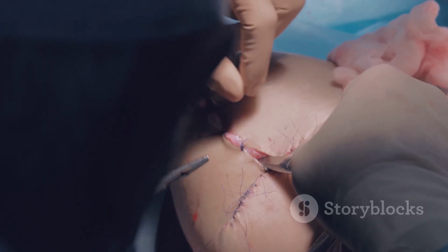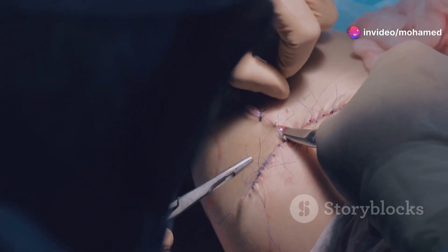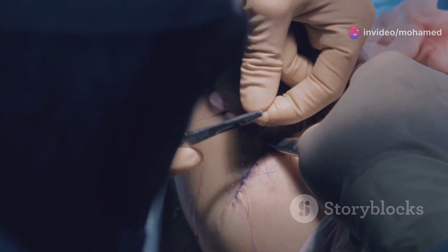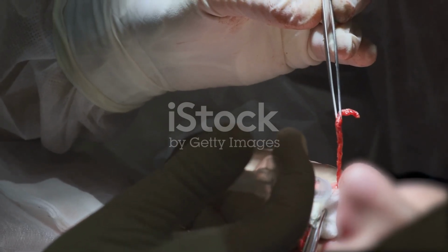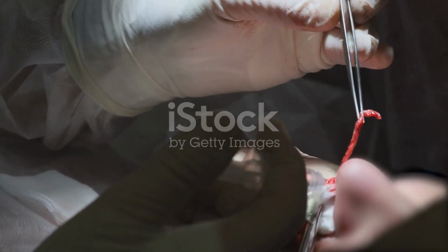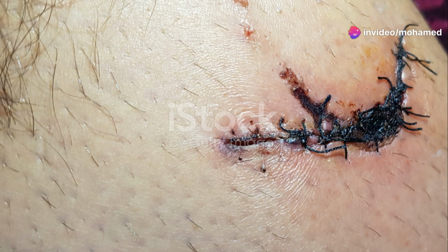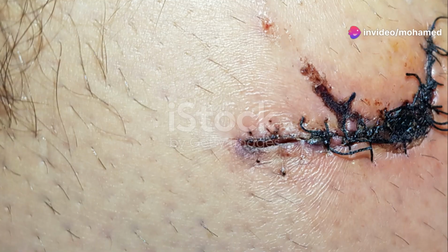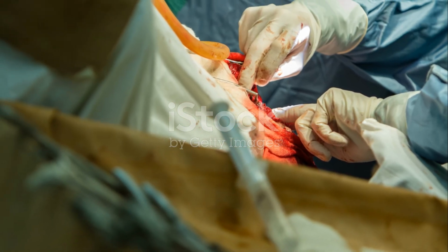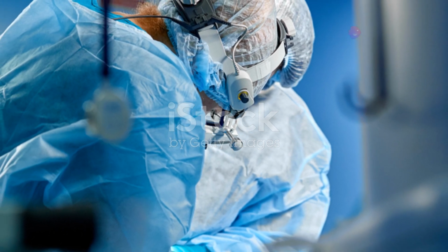Next, let's talk about monofilament versus multifilament. Understanding the differences between these two can help you choose the right suture for the right situation. Monofilament sutures are single-strand, making them smooth and less likely to harbor bacteria. Think nylon or prolene. Their smooth surface reduces the risk of infection and makes them ideal for certain types of surgeries. They're excellent for cosmetic results but can be tricky to handle. Their smoothness can make knot tying more challenging, requiring more skill and precision.